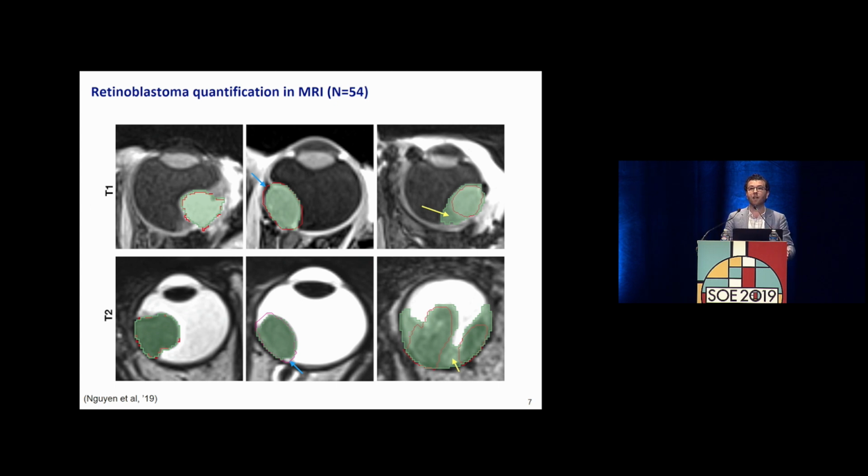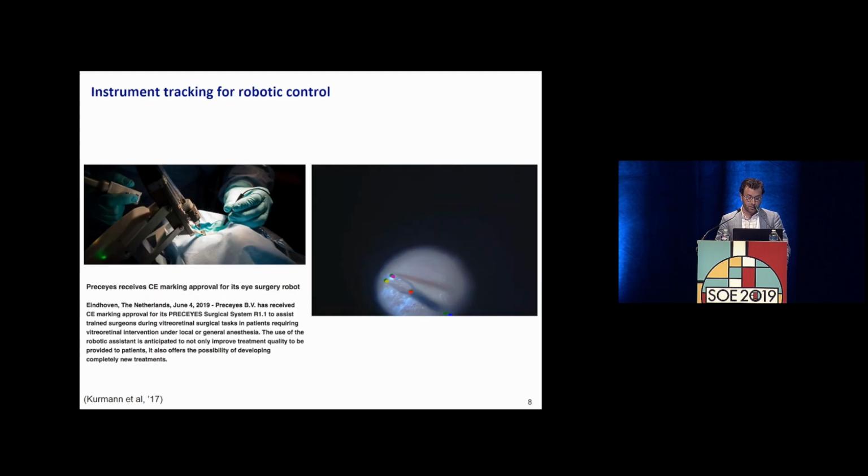Okay? But we can look at other cases or other environments where deep learning is starting to appear in ophthalmology. And this is just fresh off the press. On the left, what I'm showing you is the Preceyes robot for retinal surgery that was CE approved just earlier last week, the 4th of June of this year.